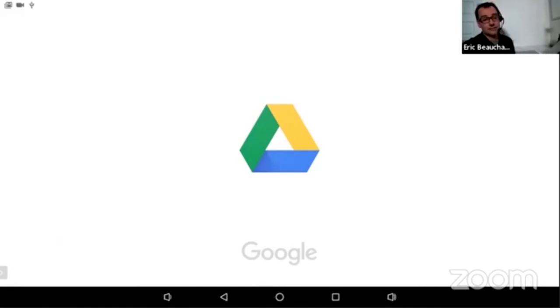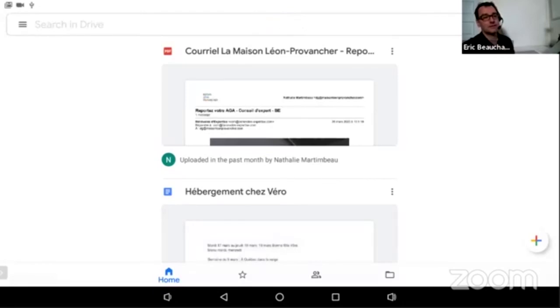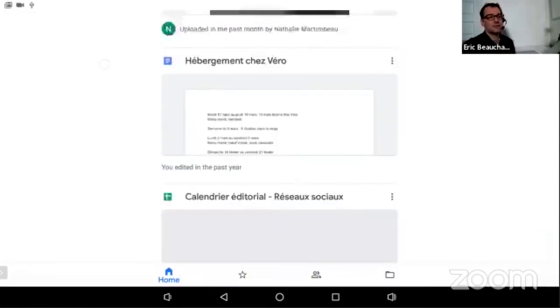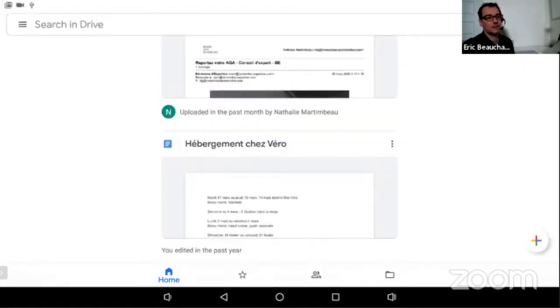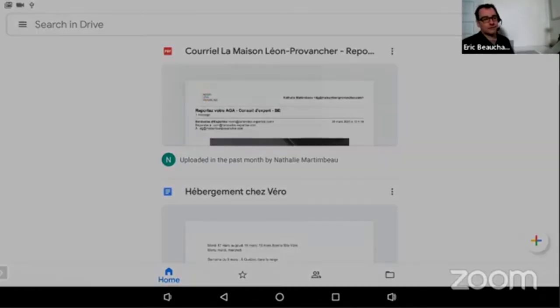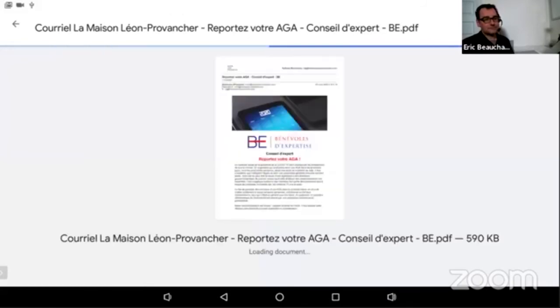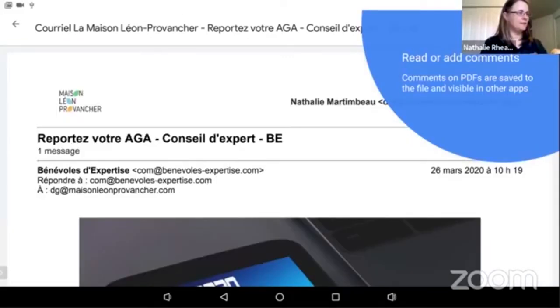if you have any PDFs, you can open a PDF from there. So I don't know if you have any PDFs there, Nally, but doesn't really matter. But you can import the PDFs directly from that drive by clicking on it and then opening and open with, and you'll have a pop-up that you'll be able to choose Prodigy, and then it's going to import it into your gallery. So I'm tapping on it. Yeah, so that's great. Okay, so we have one there.